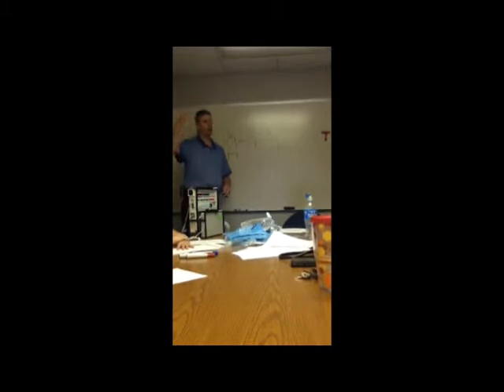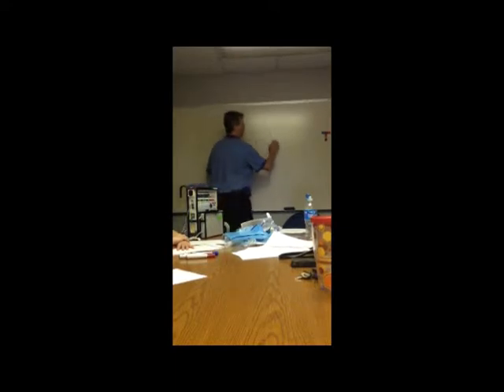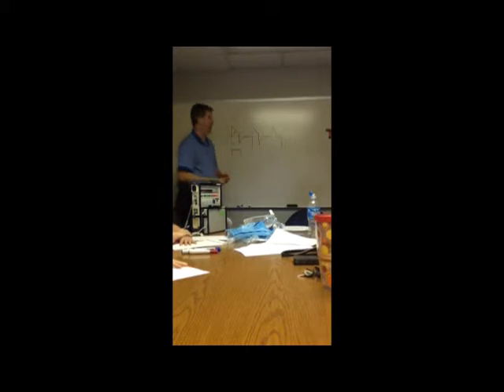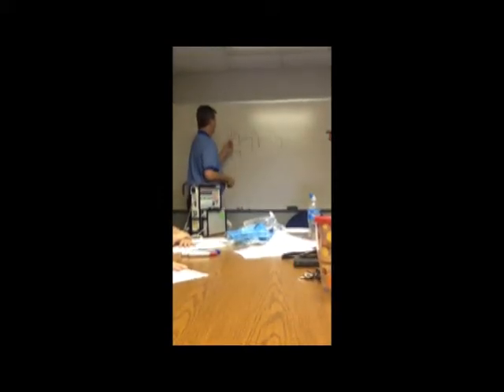So it's getting to where we're talking really sick people that we're having trouble oxygenating. Hopefully you would never need to do that. So that's part of a breath, but this is what we're working with today. This is all we need to talk about. We don't need to talk about breath holds or any of that when we describe each mode, okay? So that's the main part of a breath.